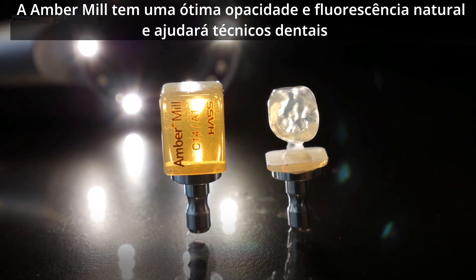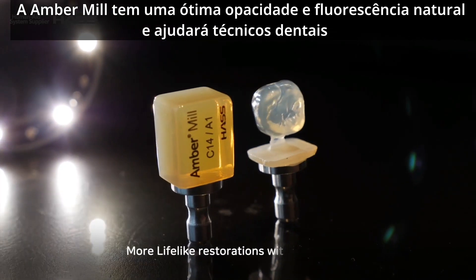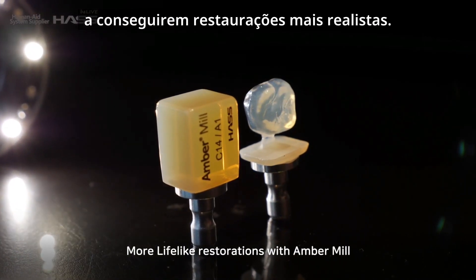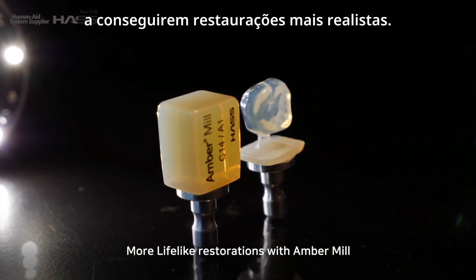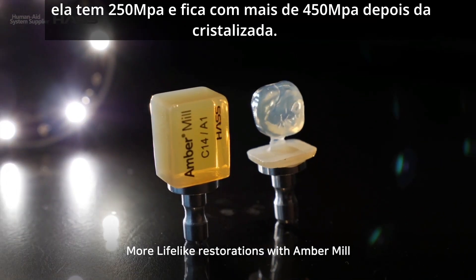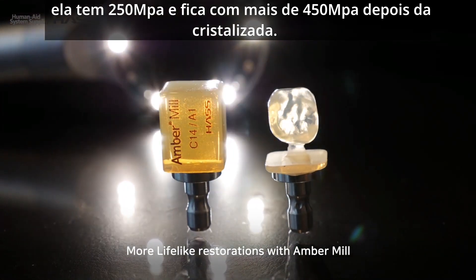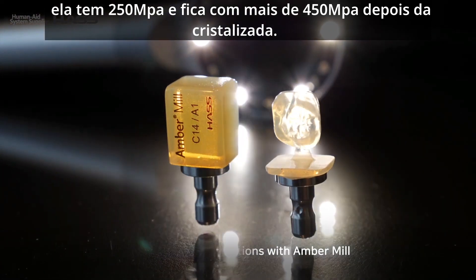Amber Mill has great natural fluorescence, and it will help dental technicians to achieve more lifelike restorations. Before crystallization it has 250 MPa, and becomes over 450 MPa after crystallization.